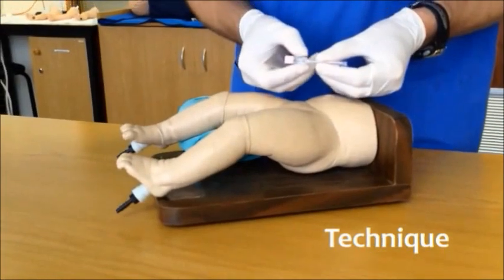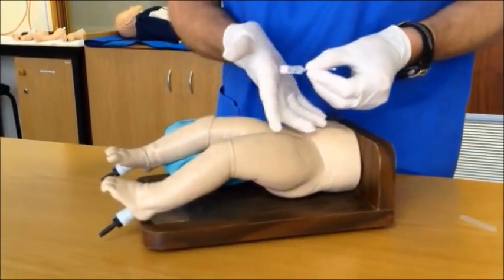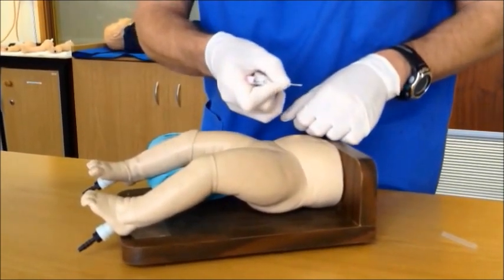To use the 18 gauge intraosseous needle, take off the sheath. We recommend holding it at the base of the index finger and then grabbing the needle between the index finger and thumb, giving you a firm but controlled grip.